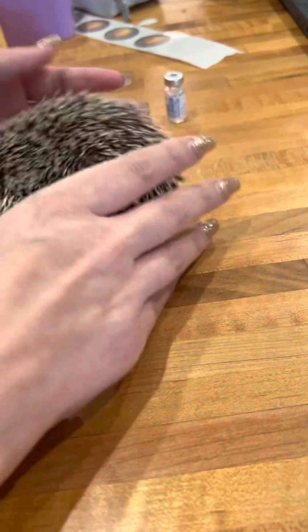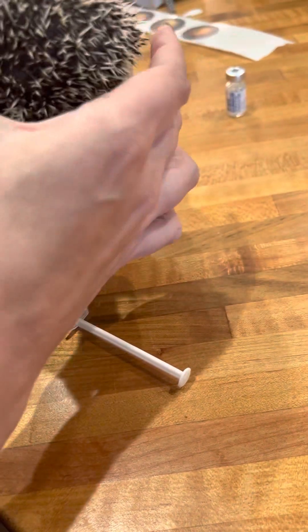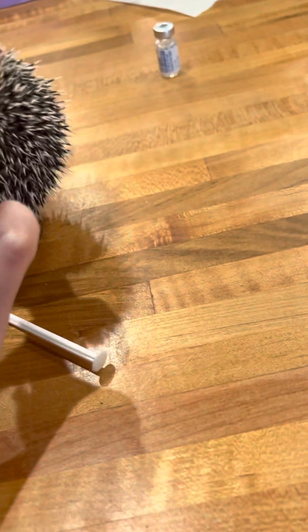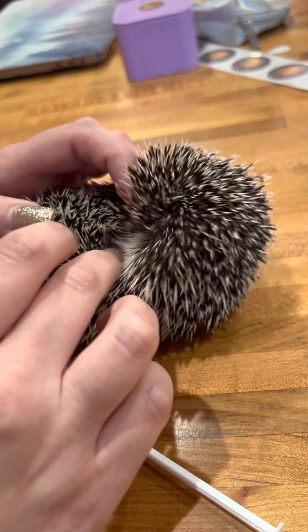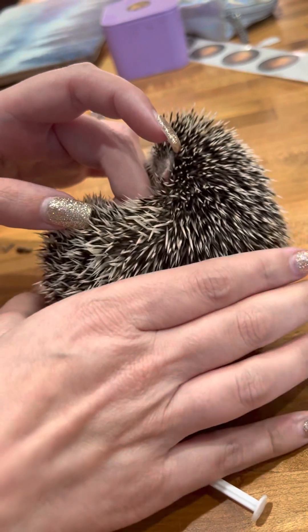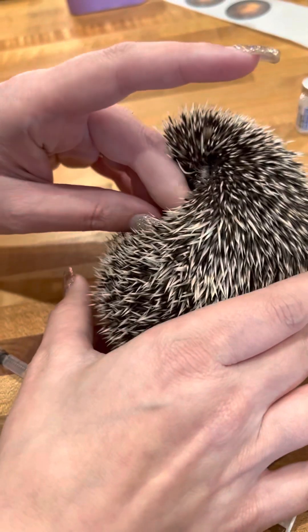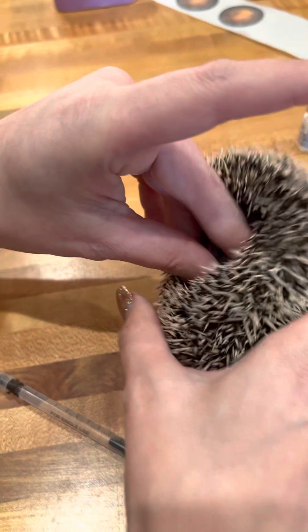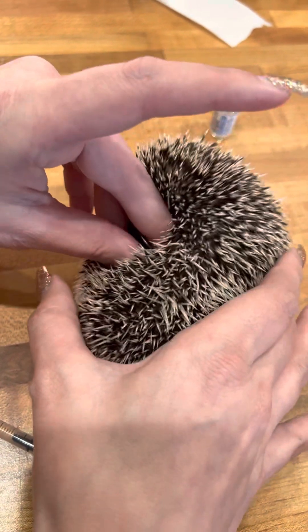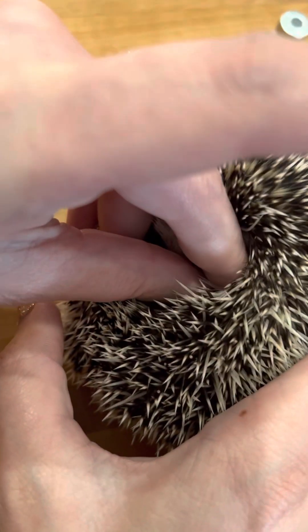Alright, the back side is going to be a little bit meatier. Wait until they're done hissing and popping at you. See if you can pinch and actually get some meat.